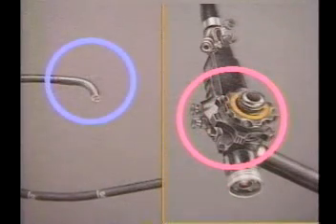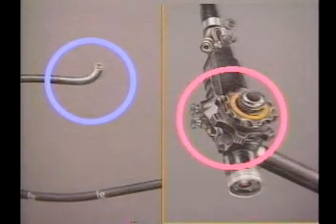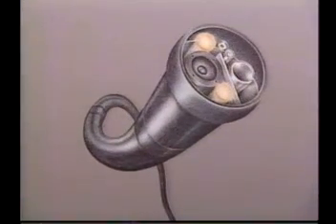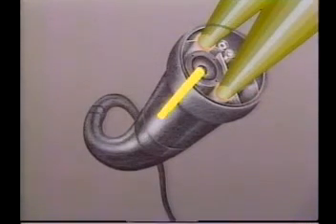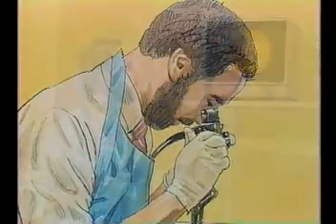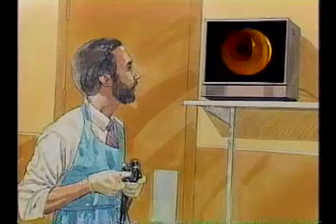The controls allow the physician to move the tip of the scope in any direction. The inside of the colonoscope contains several small channels for air, for suctioning, for instruments, and for the fiber optic transmission of light and pictures. The pictures can be seen in the eyepiece at the end of the scope, or on a television screen in the examining room.